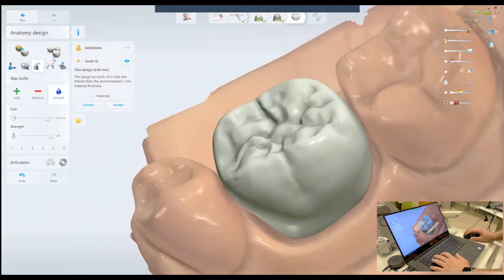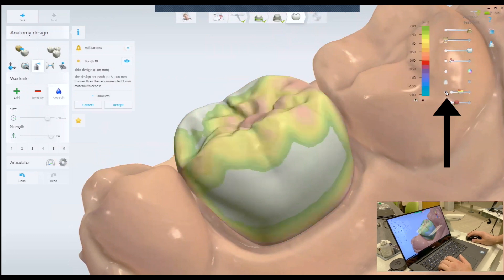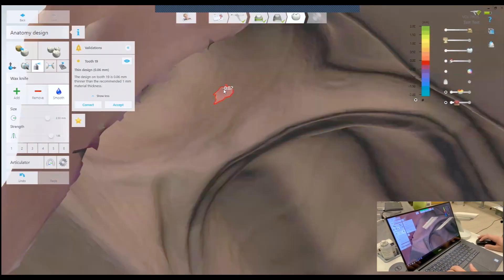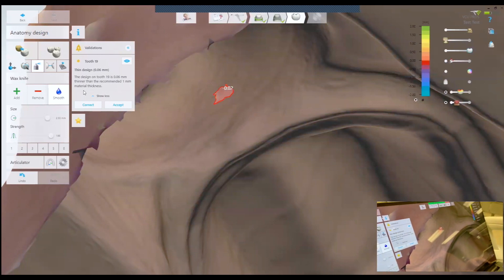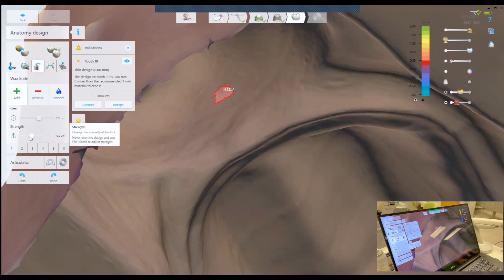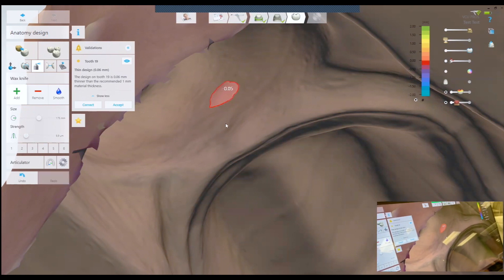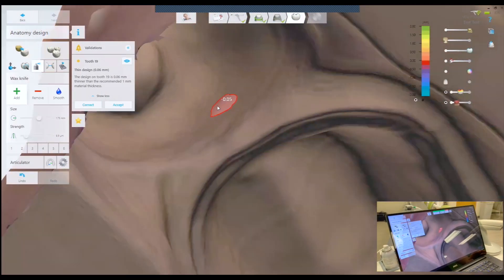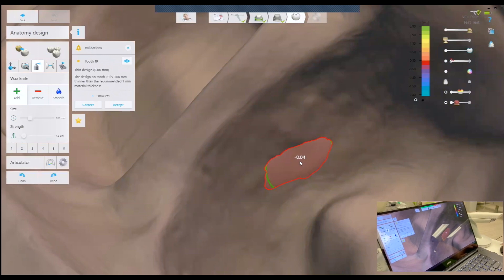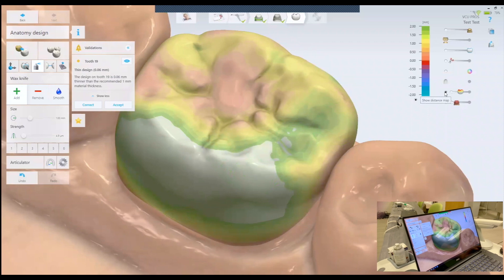The next step is to verify the proximal contacts. There's this tool right here — click this button and then look from the inside of the model. Usually you want this number to be 0.00 to minus 0.05. So I'm going to add a little bit of material on the crown. I'll decrease the brush strength, and now we have 0.05 into the adjacent tooth, which is 50 microns. Looking at the distal contact — it's 0.04 — I'll add just a tad to make it minus 0.05. Now we have our proximal contacts in a good place.